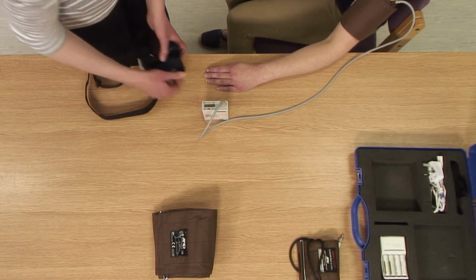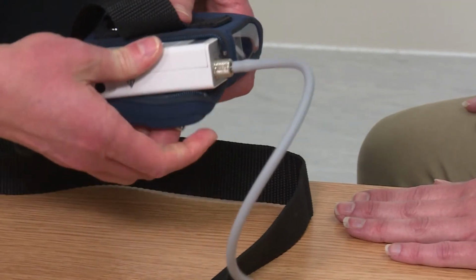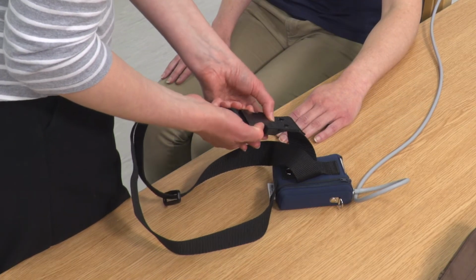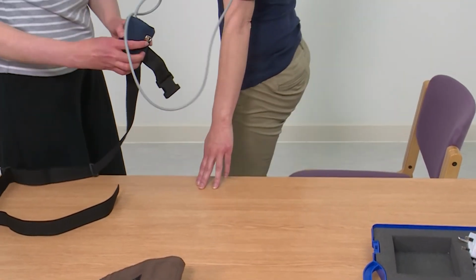Instruct the patient to have as normal a day as possible. Ideally, when they feel the cuff inflate, they should take a seat with the arm supported. If this is not possible, they should try to stay still with the arm across the midriff until they feel the cuff fully deflate.